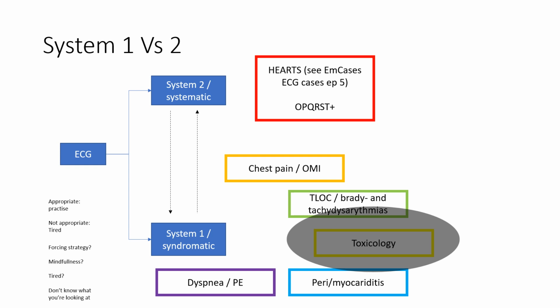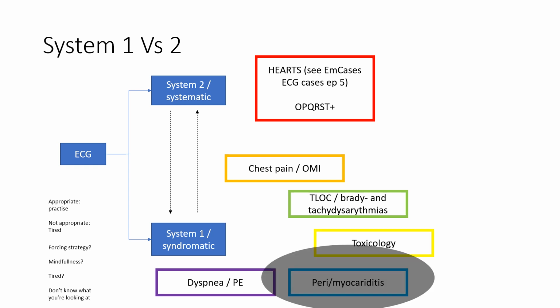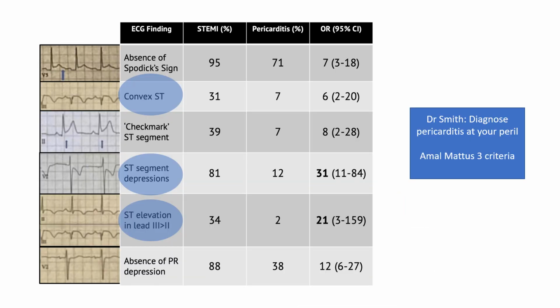All right, that's toxicology. Moving on to pericarditis, just one slide here. Dr. Smith usually says that you diagnose pericarditis at your peril, and I'm going to have 3 criteria, which are these that may distinguish between STEMI and pericarditis.